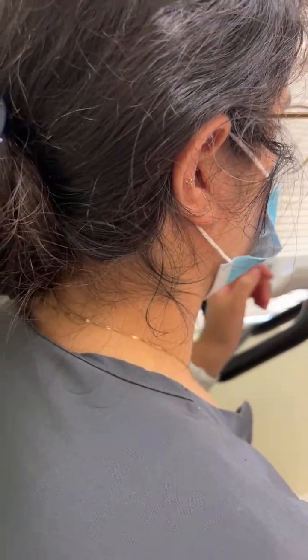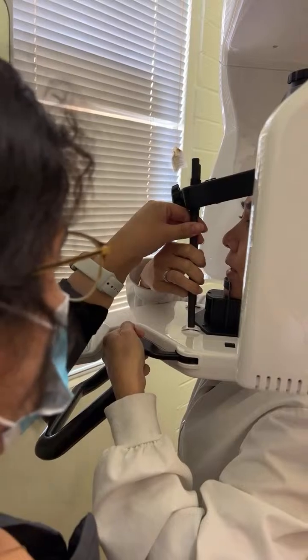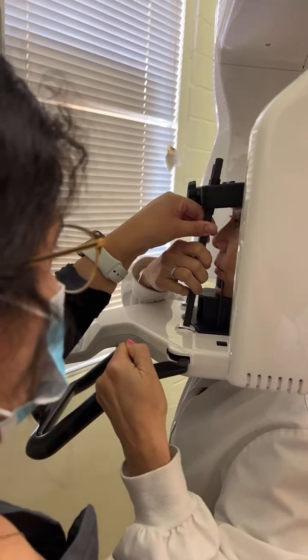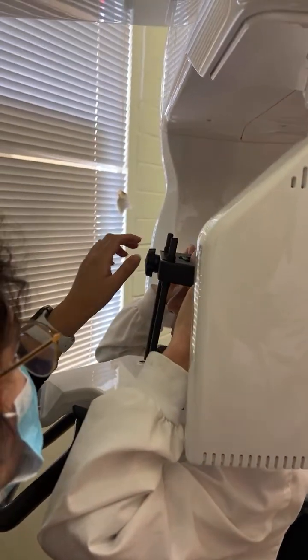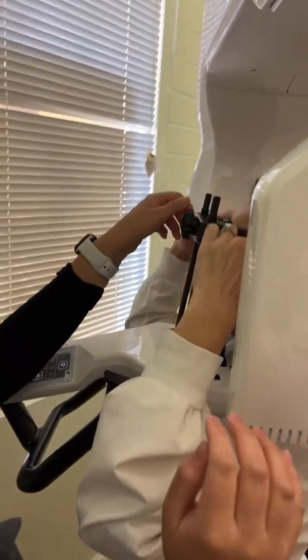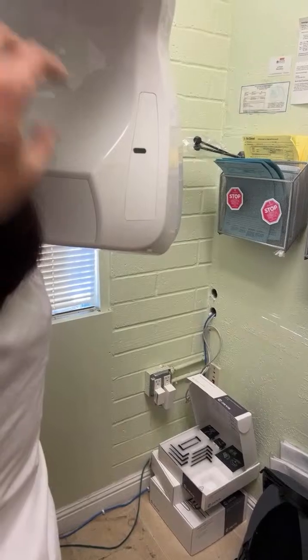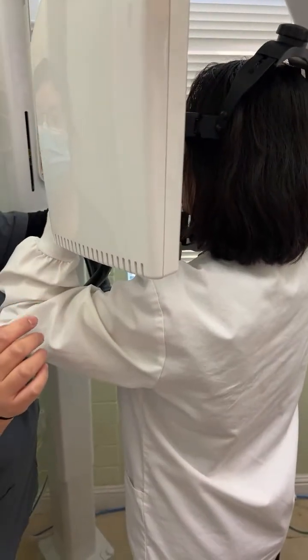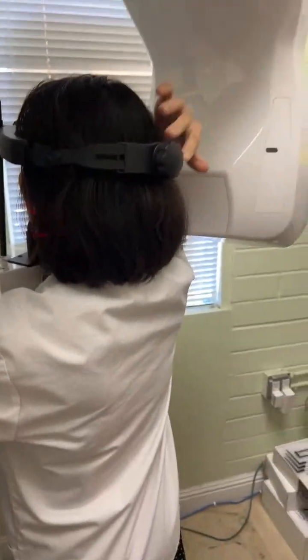Like this, right? First, you hold this one, one hand hold this one, and one hand release this. And then you bring it closer. Hold the rest of my forehead. You see that? Then lock it. And then put this one down. Parallel with this one. And then you tie it. Tie the temple on the back here. Now release and then tie back. Make sure this one is parallel with this one first, before you tie, and this one goes back here, and then you tie it in the back.